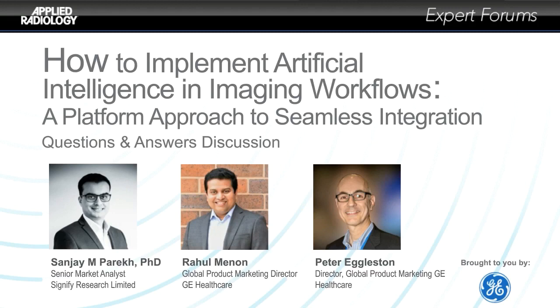And then we also have a certification lab in our offices in Chicago where we put them through the rounds. We don't actually recreate their evidence, but we ensure it's scientifically valid. We run them through minimal tests for business viability, and also that they've properly utilized our open API and certified that the integration has been done. So, certainly, I think we want to leave that up to the customers themselves, but we're trying to assist, at least during these initial times of organizations onboarding AI.